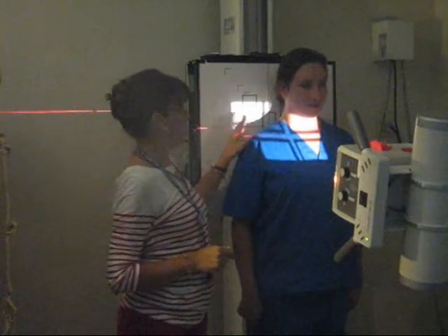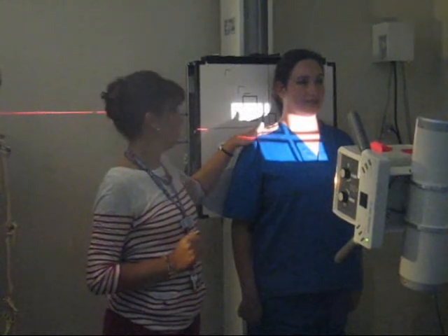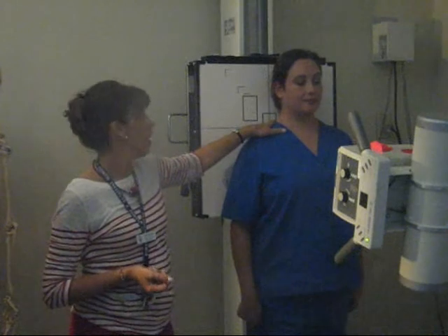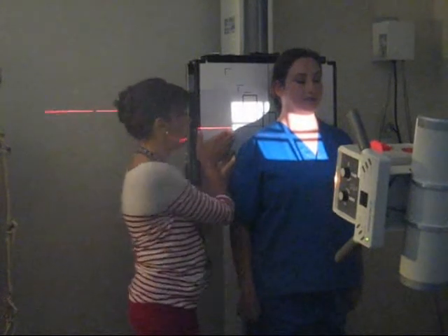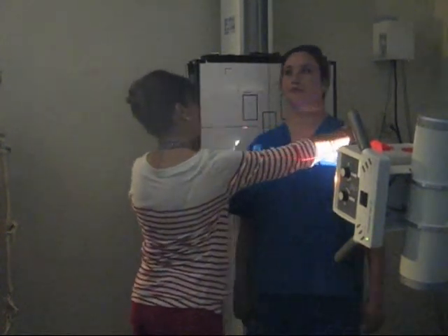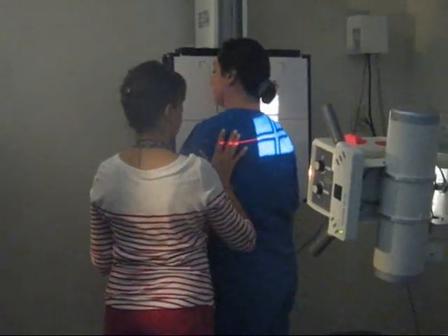And you have your axial, your PA axial of the right clavicle. Okay? For detail purposes, of course, you want the body part of interest as close as possible to the IR, the image receptor. So you can do it if you turn your patient completely around to the side, still keeping the right clavicle closest to the IR.